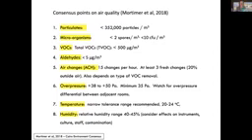The temperature and the humidity, which we described as optimal between 40 and 45%, all depend on location, staff, contamination, and culture system, and of course important are the potential effects of high humidity as well as low humidity on instruments and people.